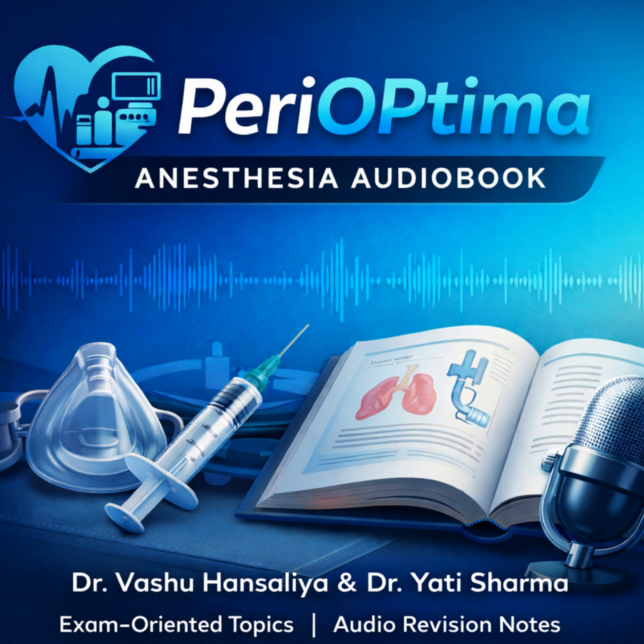You have to give them a very long time to exhale. So you'd use a low respiratory rate and a short inspiratory time. This creates a low IE ratio, like 1:3, or even 1:4. You are prioritizing expiratory time above all else. Makes sense. Okay, last one.